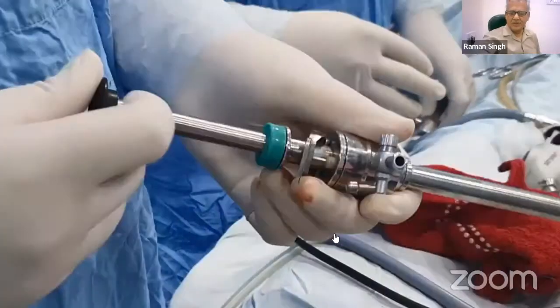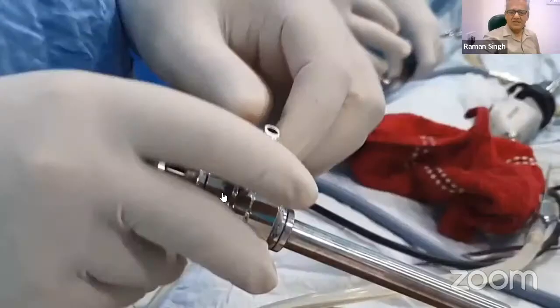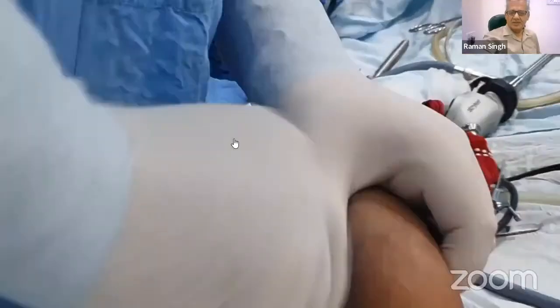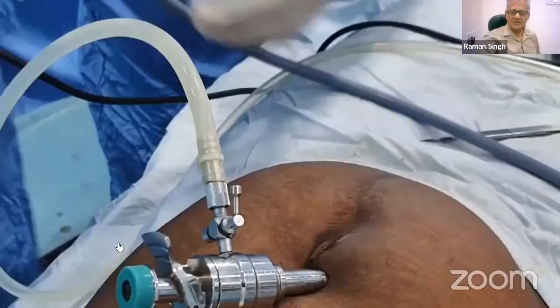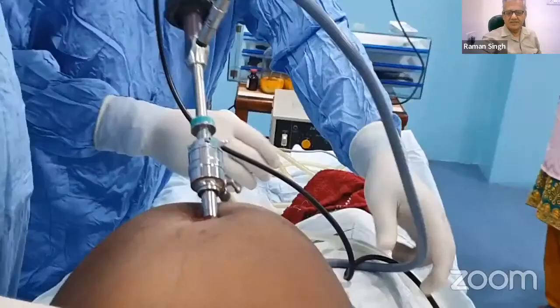After creating pneumoperitoneum, the first port is created by pushing a 10 mm cannula inside the abdomen, holding the abdominal wall and pushing the trocar toward the pelvis, where there is no structure which can be damaged. Then the diagnostic procedure is performed. Pneumoperitoneum is created, camera is in.